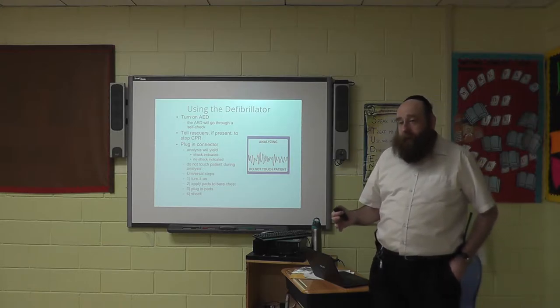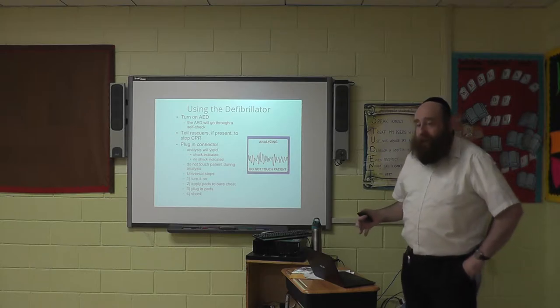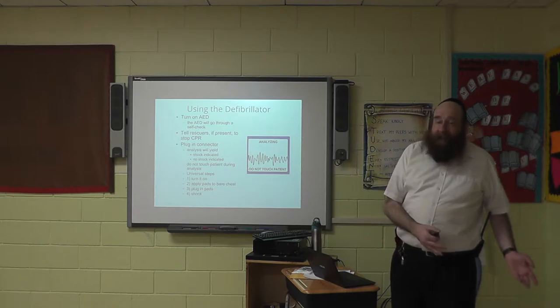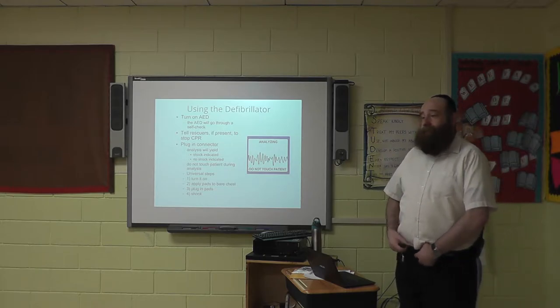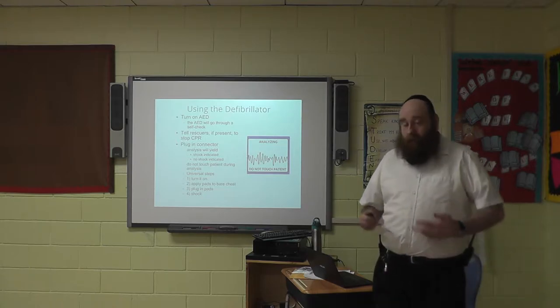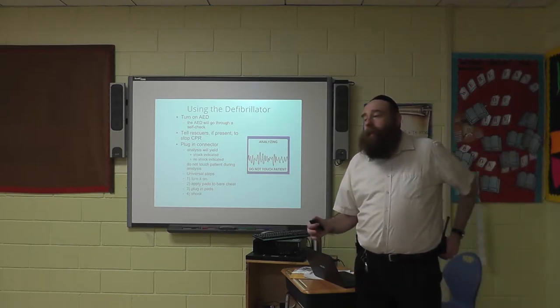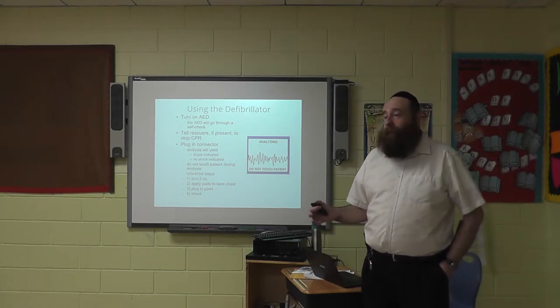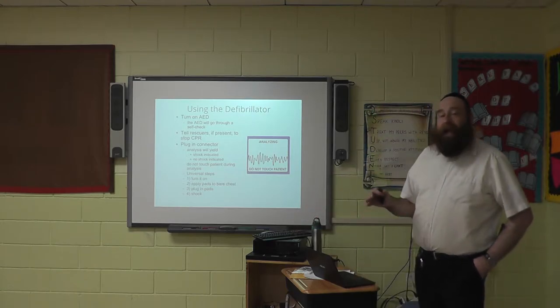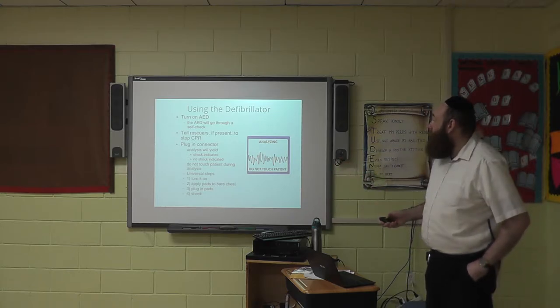Defibrillators will talk to you. Unfortunately, when we're doing CPR in a crazy environment, in a crazy location, you're not going to be able to hear it. And if you've got to listen to it, you know, change your day job. You've got to know how to do this. So you're going to practice on, I have great defibrillators here. They're made by Fisher Price. They're my first defibrillator. And that's what they look like. But they actually operate in exactly the same way as the real ones.